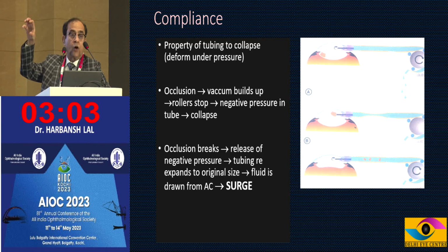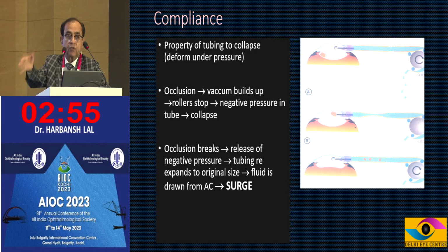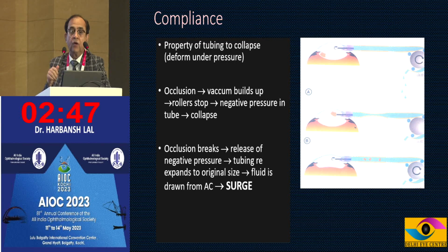So depending upon how much it was blocked, if we can raise your foot pedal, like when you decelerate the car, once you know that you have reached your destination, you decelerate beforehand. So if you can imagine that the piece is going to get sucked now, before it gets sucked, if you can lower the settings, I mean lift your foot slightly up, probably the surge will be much less. So that depends upon your vigilance. If you keep on pressing the foot pedal while it is getting sucked, you will have a much higher surge.